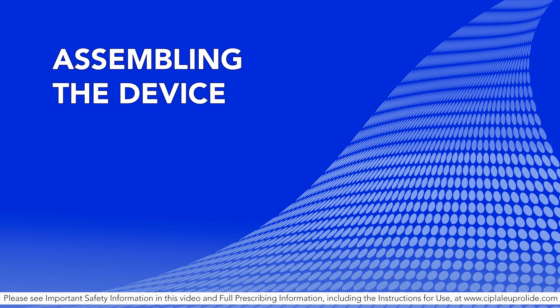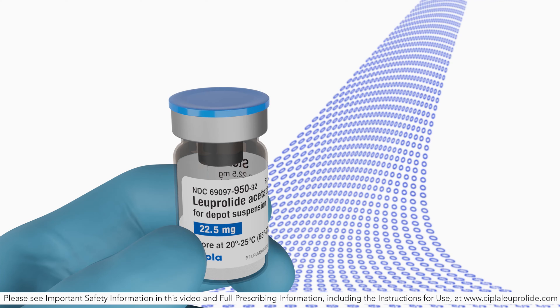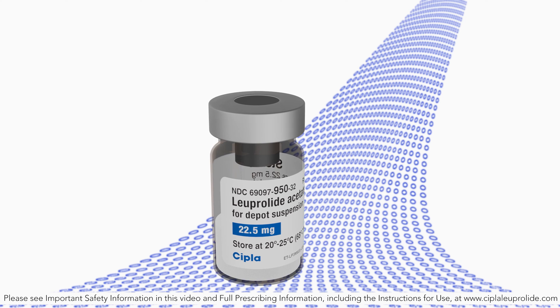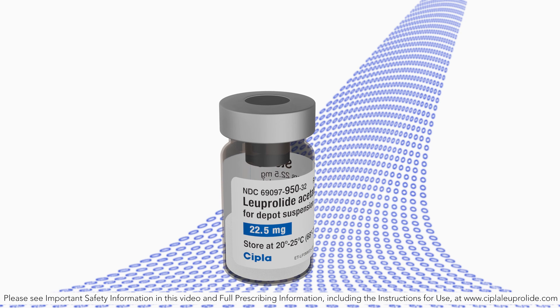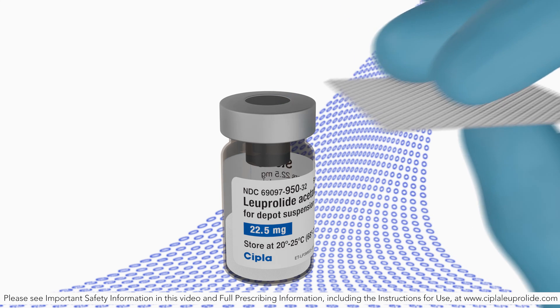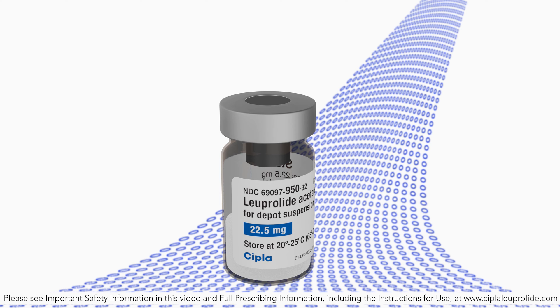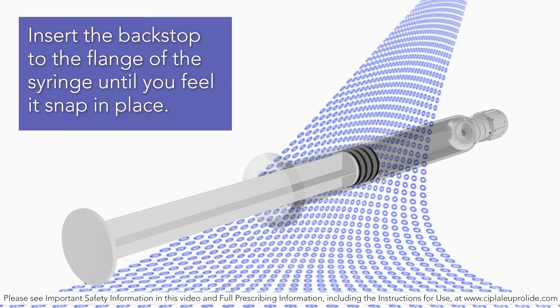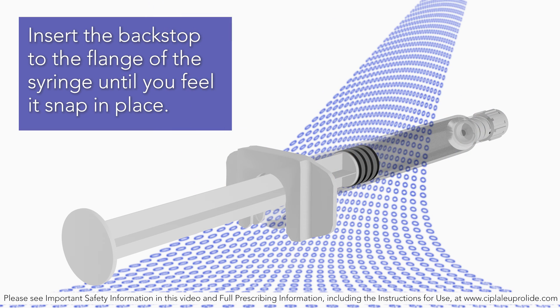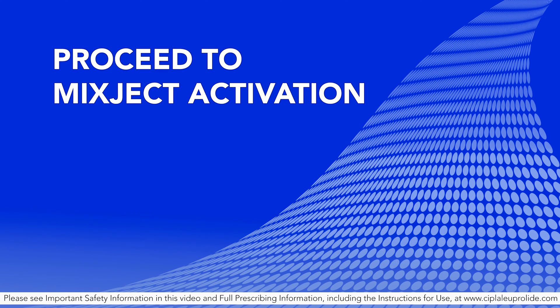Assembling the device. Remove the flip-off button from the top of the vial, revealing the rubber stopper. Place the vial in a standing upright position on the prepared surface. Disinfect the rubber stopper with the alcohol wipe. Discard the alcohol wipe and allow the stopper to dry. Insert the backstop to the flange of the syringe until you feel it snap in place. Proceed to mix-ject activation.